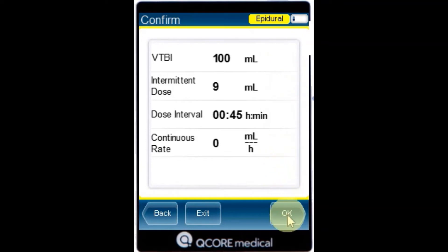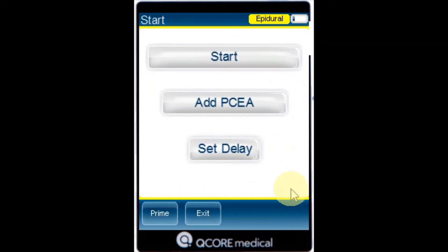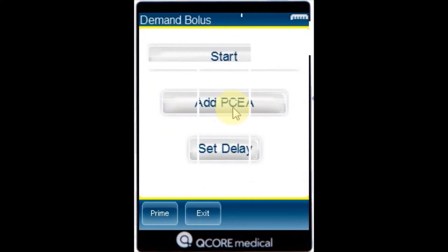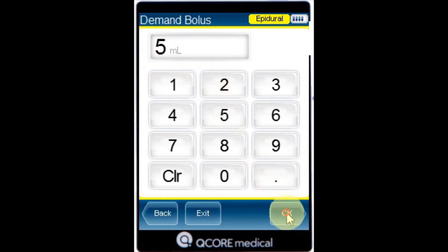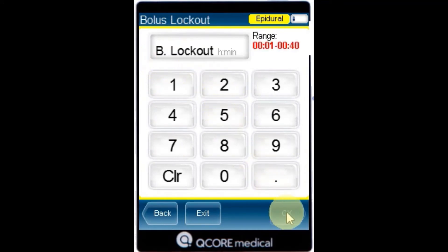From the Start screen, select Add PCEA. Using the keypad, enter the value for the demand bolus and press OK. Using the keypad, enter the value for the bolus lockout, then press OK.